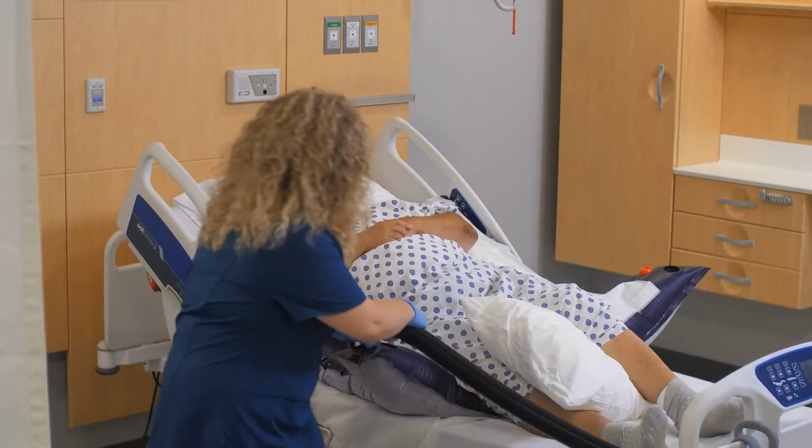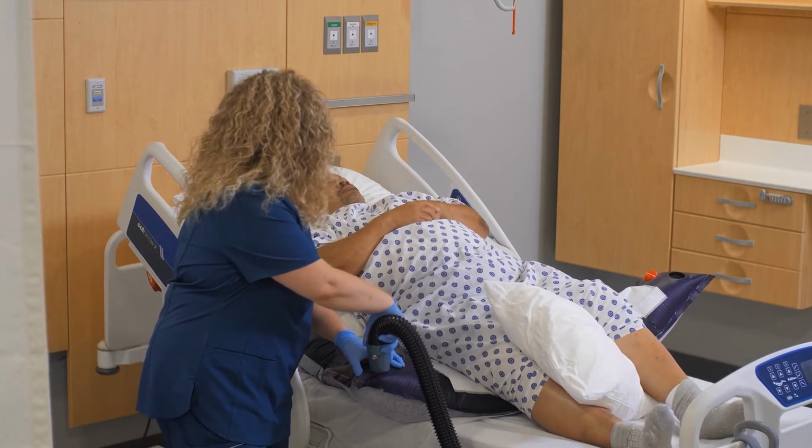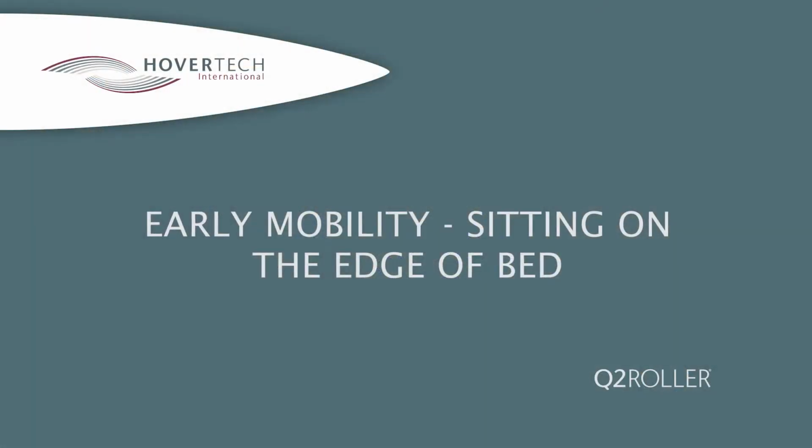If the patient needs assistance with stabilization when sitting in bed, the Q2Roller can be used with both chambers inflated to stabilize patients who commonly list to one side. Inflate both chambers and adjust to straighten the patient.